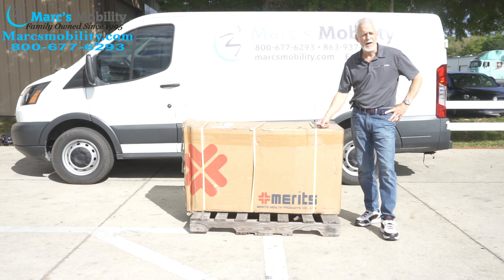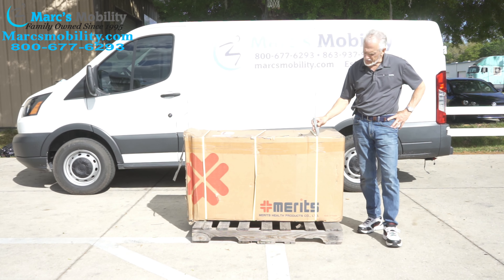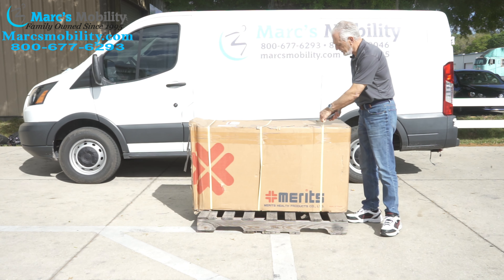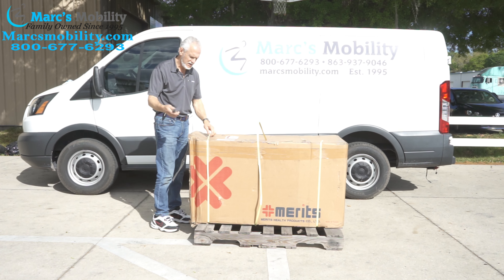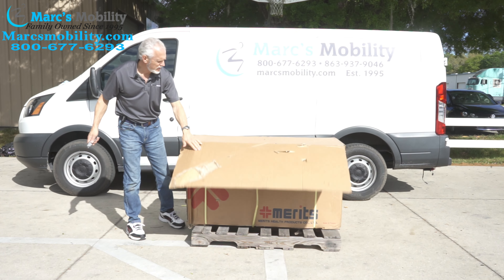This is a Meritz Pioneer 3 scooter with a seat lift. If you get a scooter from Meritz, this is the Pioneer 3. It'll come in a box like this on a pallet. The first thing you'll do is cut the ties on the box. The only thing you really need is a good box cutter. Then you can open the box like this.